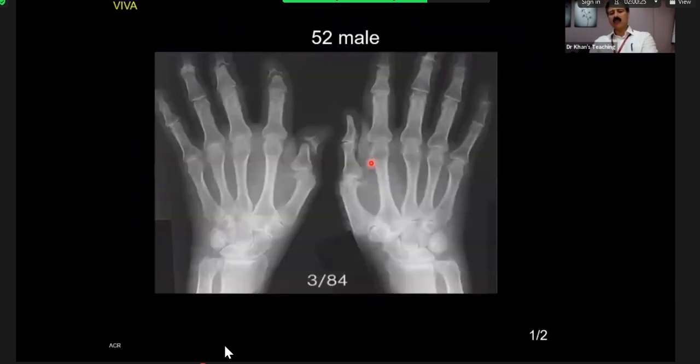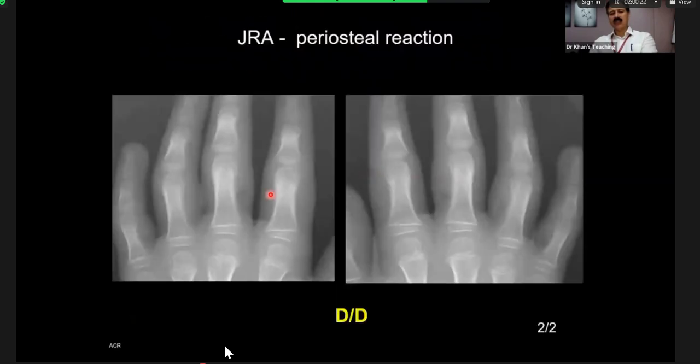And because the age of this patient is not an infant or a neonate, that's the key. And things like pachydermoperiostosis, which can happen in a teenage patient, we'll see it later today, that might be kept in mind. I think nothing else. And the counter argument against that will be that usually those patients are much older than this.